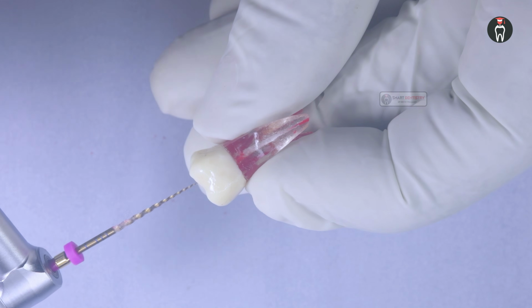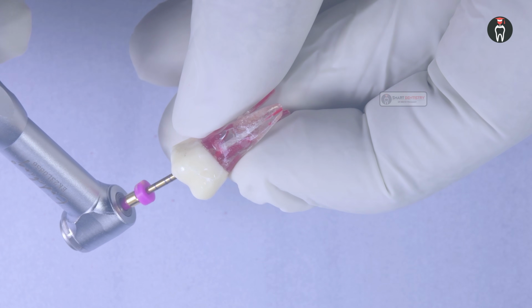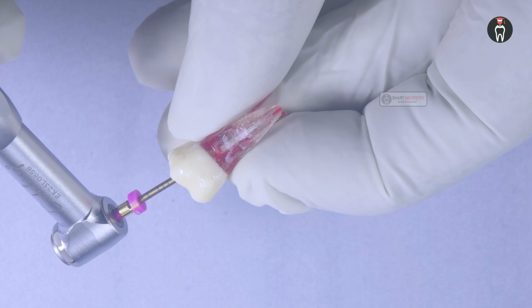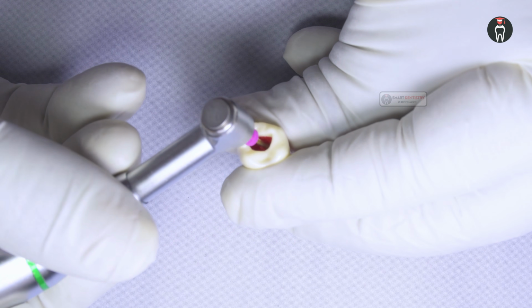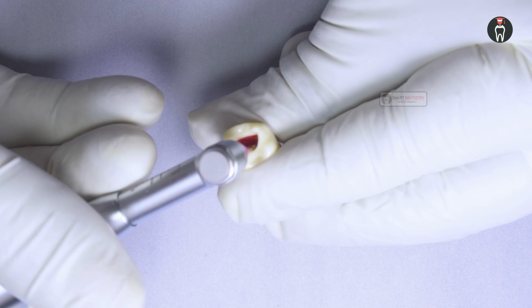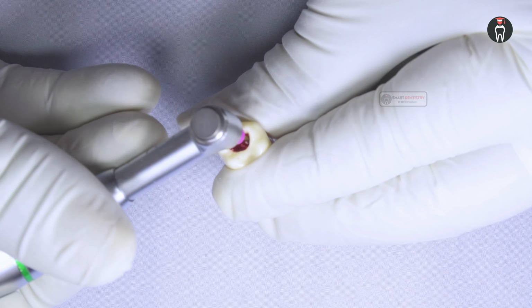Most of the files recommend a pecking motion. So whenever you are using a pecking motion, there is a chance that we may give excess pressure while pecking or pushing, and the file may go beyond the apex, or it may get screwed inside the root canal. So instead, you can use something called a brushing motion. What is this brushing motion? So you are pushing the file in one angle, and while removing the file, you will scrape it across any one of the walls, like mesial, distal, buccal or lingual, and you will remove the file. This is called a brushing motion.